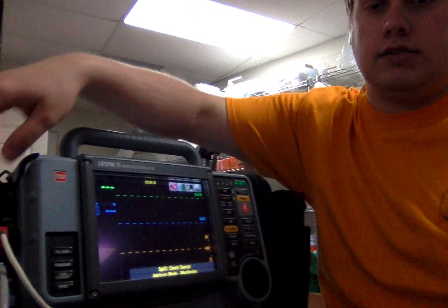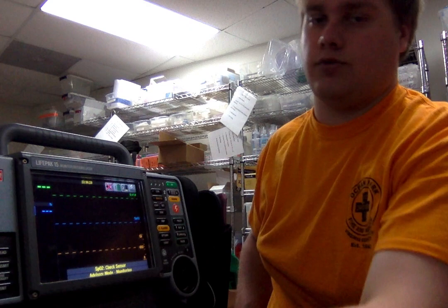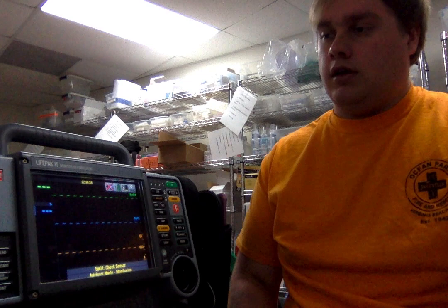You have the options for both 4-lead and 12-lead in this pocket. You have all of the leads for your 12 and for your 4 for continuous monitoring, as well as a pulse ox as normal and continuous blood pressure monitoring, or non-invasive blood pressure monitoring.